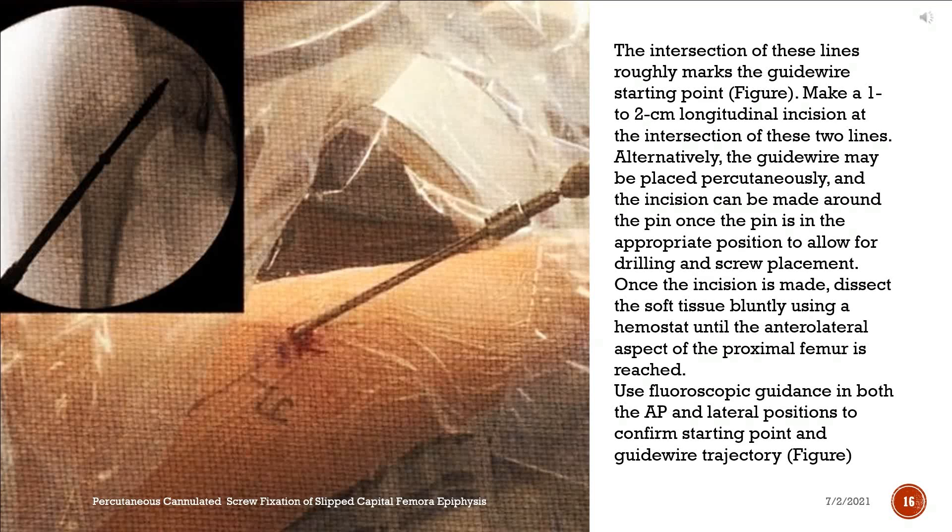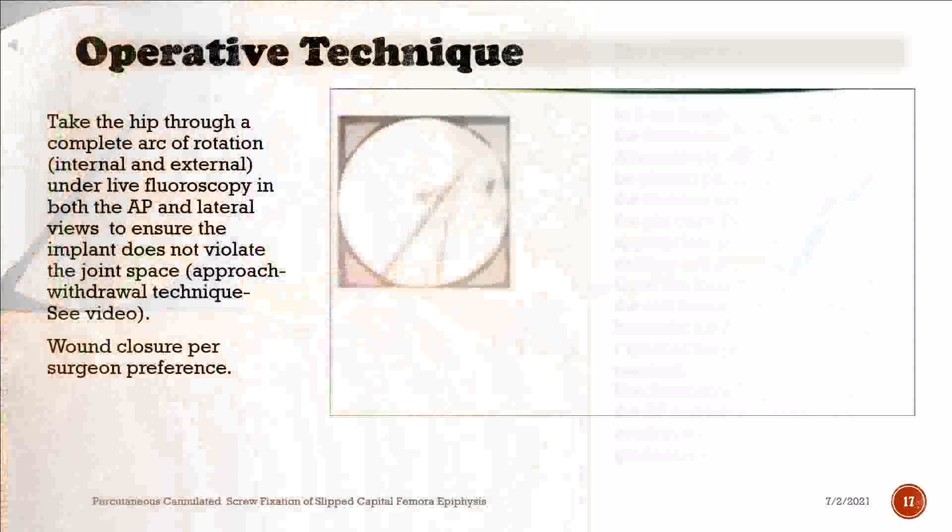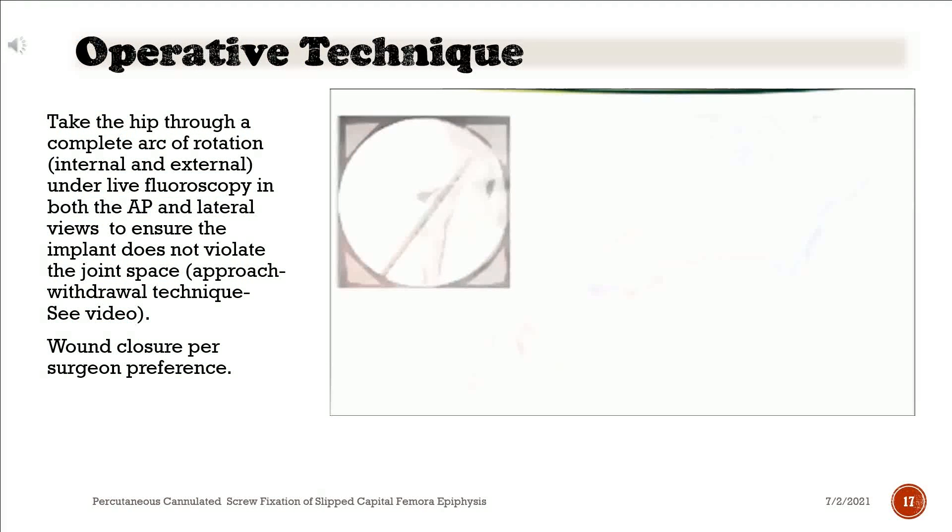Once the incision is made, dissect the soft tissue bluntly using a hemostat until the anterolateral aspect of the proximal femur is reached. Use fluoroscopic guidance in both the AP and lateral positions to confirm starting point and guide wire trajectory. Take the hip through a complete arc of rotation, internal and external, under live fluoroscopy in both the AP and lateral views to ensure the implant does not violate the joint space. Approach-withdrawal technique: see video. Wound closure per surgeon preference.